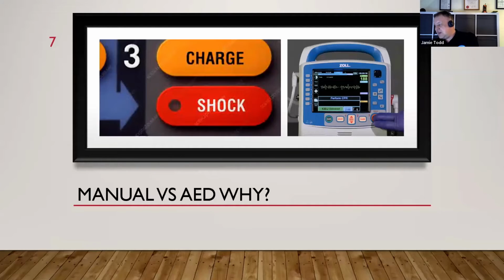The older AEDs and AED models couldn't do that at all. We know the older AEDs were very slow. And just to make sure they were 100% right, they used to generally analyze twice. So they'd do a full analysis of the rhythm, and then they'd do analysis of the rhythm again. Any sort of movement artifact or anything like that would cause it to dump and recycle. And then it was charge, and the charging technology wasn't that great, so that took quite a while as well. It was quite common to have pauses of 20 seconds plus on automated machines.